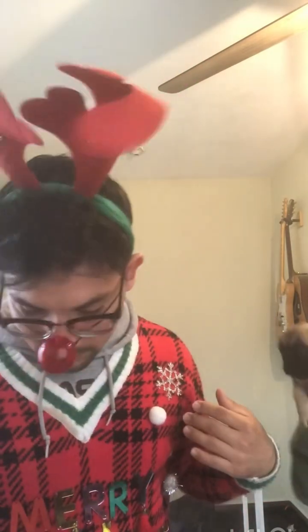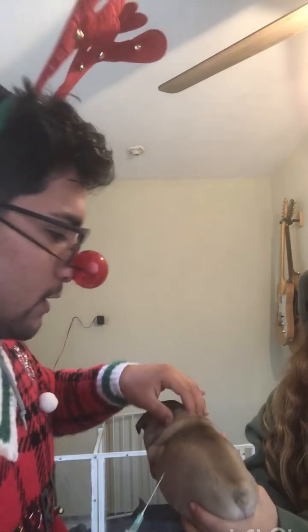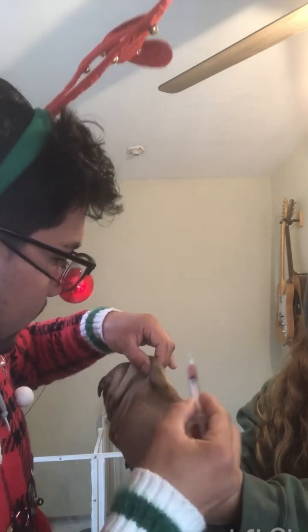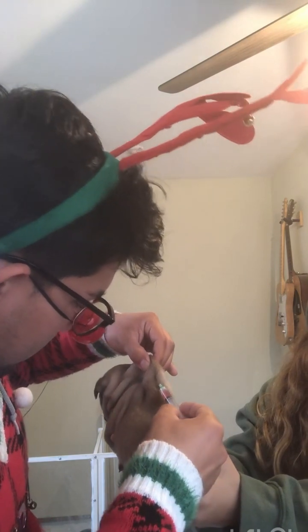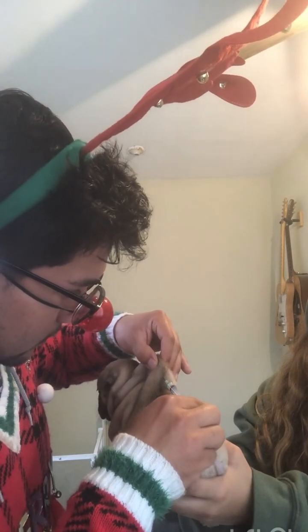What we're going to do is pull up the skin as far as we can without hurting the puppy and try to inject upwards. Be careful not to poke your own fingers — that's why you pull up the skin and go right underneath your fingers. You want the hole of the needle to be facing upwards. This is Prada, from our EC's and Lucky 7 litter — a gorgeous girl. We're going to look for the shoulder blades, pull up the skin, and with the eye of the needle facing upwards, inject going upwards.